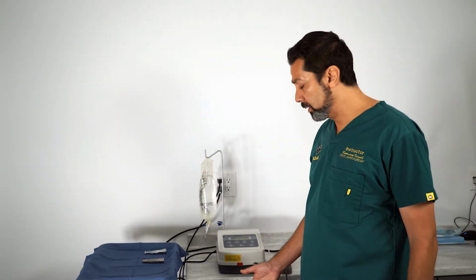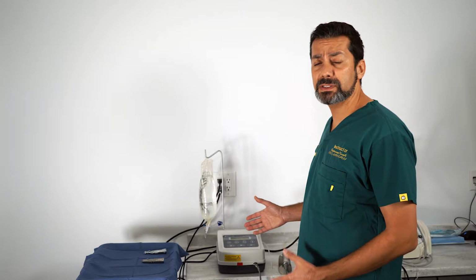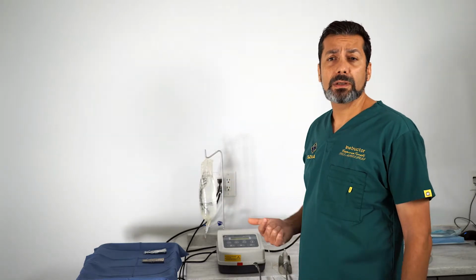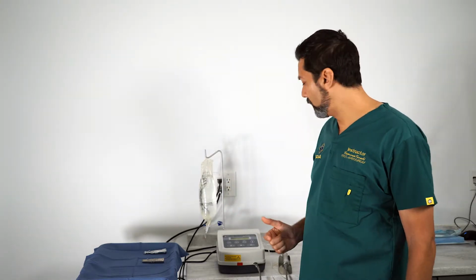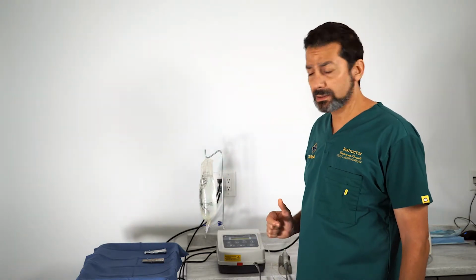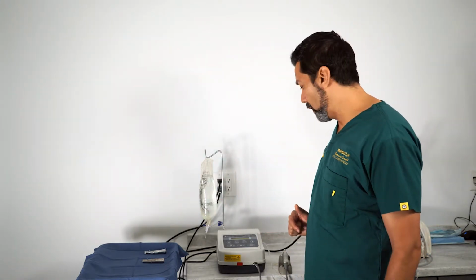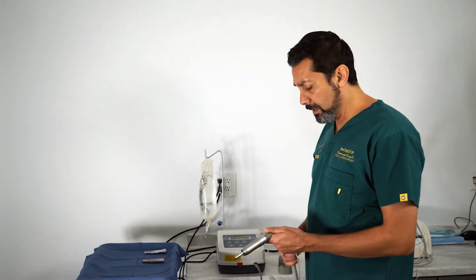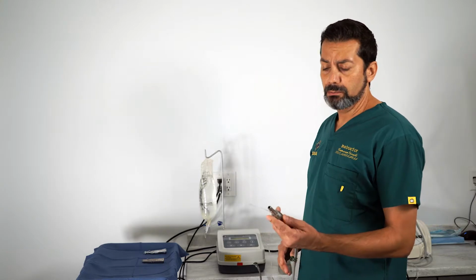On the foot pedal, you can change the programs that you've previously assigned to the motor. You can change the direction of the motor, reversed or forward. You can also change the amount of irrigation that you want coming out of the saline hose. Now, you also have the actual motor.